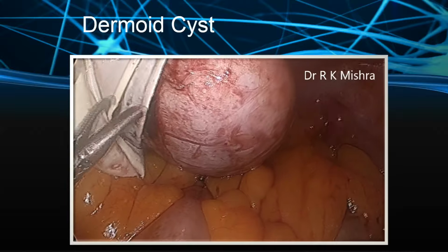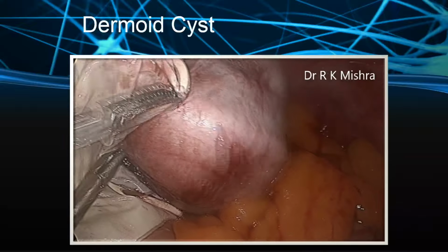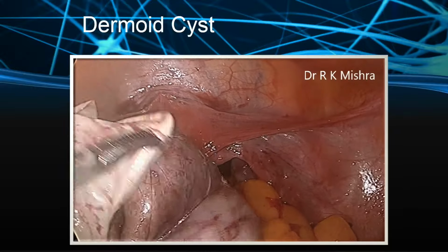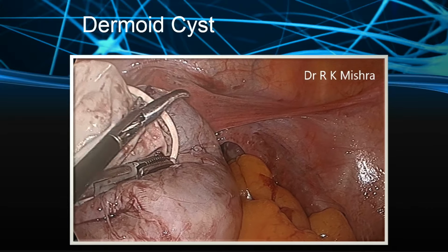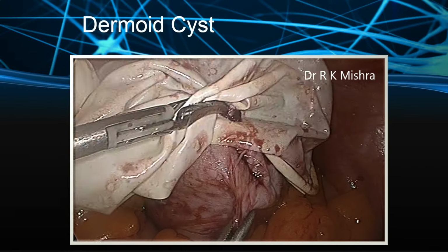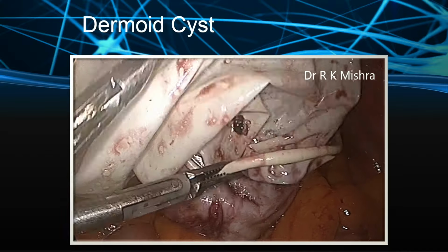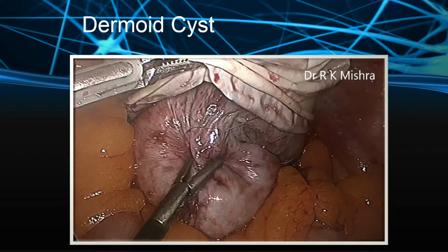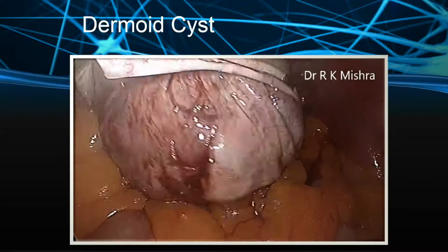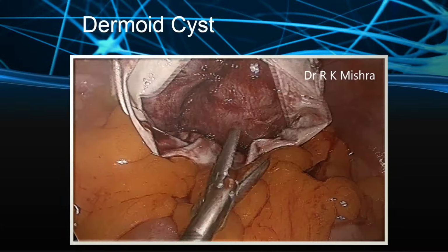Edges have to be a little bit stretched, negotiate it. It is turning out to the other side, then again control it and bring it properly. Sometimes in this type of maneuver, content keeps on spilling. So, better is to use a good quality commercial bag. Roll it in and press it with the left hand, again roll it, again press with the left hand, again roll it, press with the left hand and now it goes in.